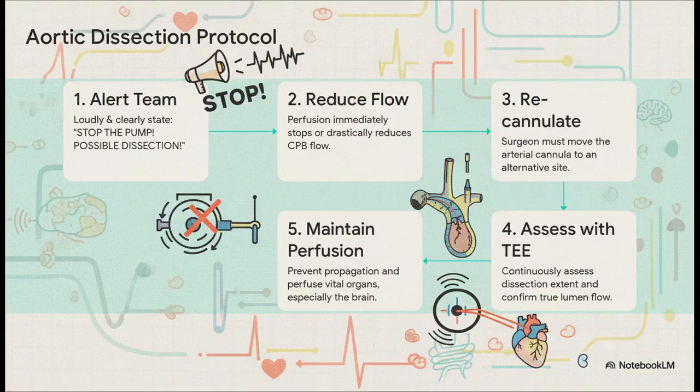Your response here can't be a thought process. It has to be a reflex. The second you suspect dissection, you have to speak up, loudly and clearly. Stop the pump, stop the damage. From there, the focus immediately shifts to supporting the surgeon as they figure out a plan to recannulate and get flow back into the true lumen as fast as humanly possible, with us guiding every step with the TEE.